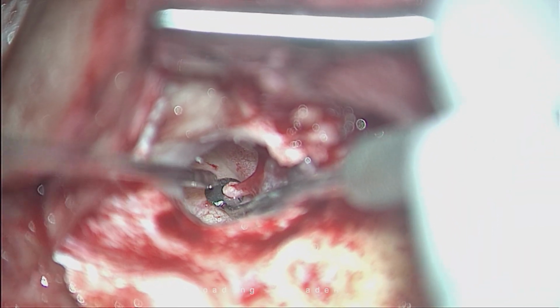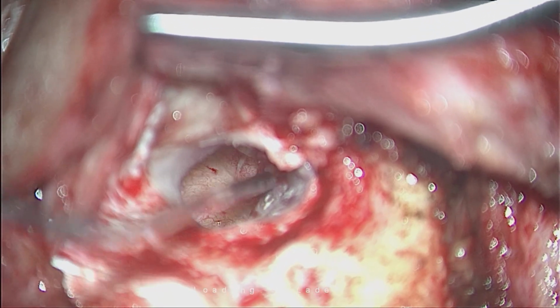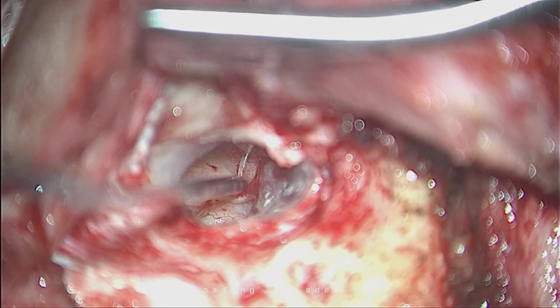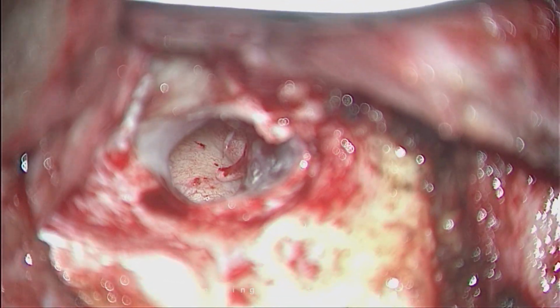Okay. I am not of the opinion to cut the malleus the majority of the time. If the tip is embedded in the mucosa with fibrous tissue, I would elevate it, and I would rather prefer to cut the tendon than nipping the malleus.